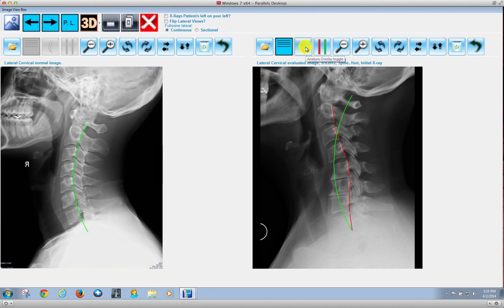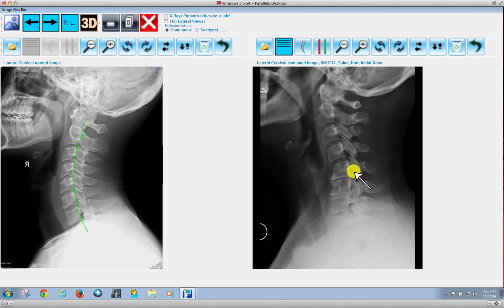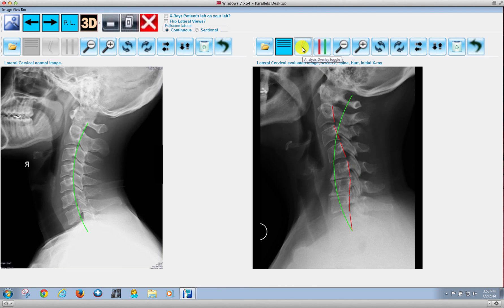We have this Curve button here, which will allow us to hide the curve lines. So that way, if there was a spur and we wanted to show that to the patient, we could go ahead and remove the lines, which is very, very helpful.